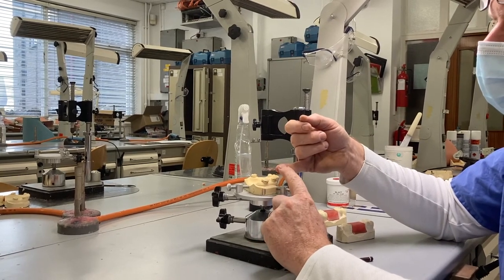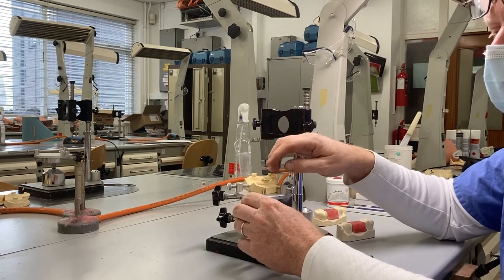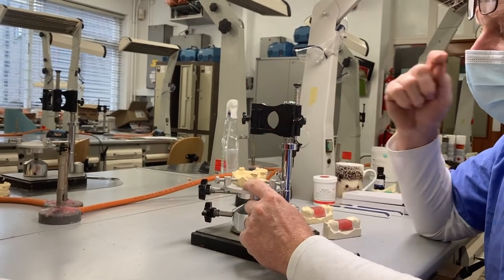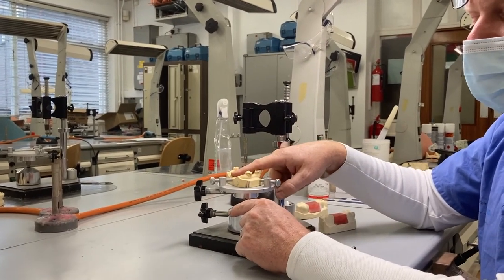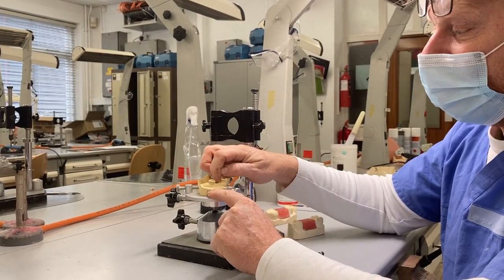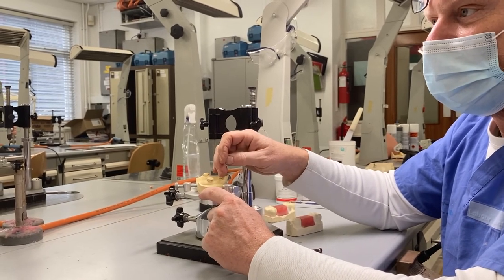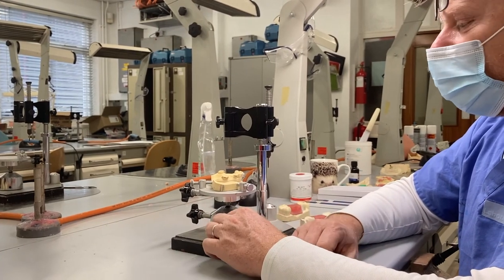You should also know where to position clasp arms and clasp tips, and whether any preparation of the tooth is needed to modify the undercut — for example, adding composite to create undercut for a clasp tip. You should be knowledgeable about the technician's role: they'll need to know the path of insertion, so you need to know how to communicate that to the lab. You also need to understand the consequence of having this undercut — that it's going to be blocked out, and that will result in a gap between the denture and the abutment tooth.